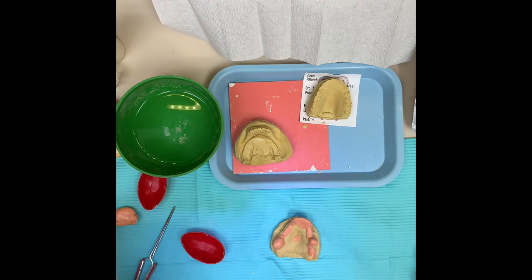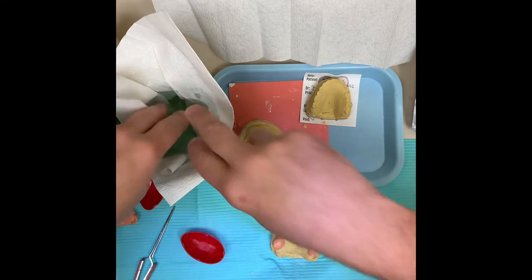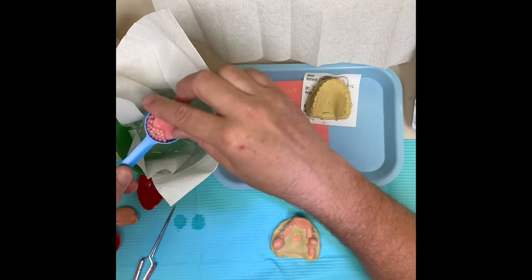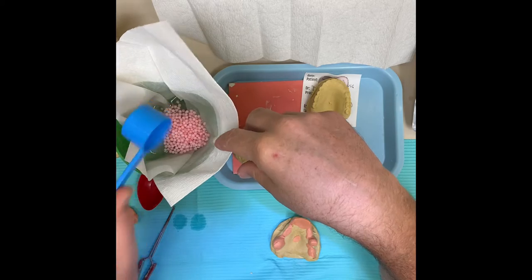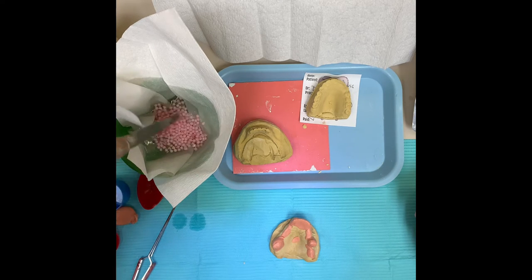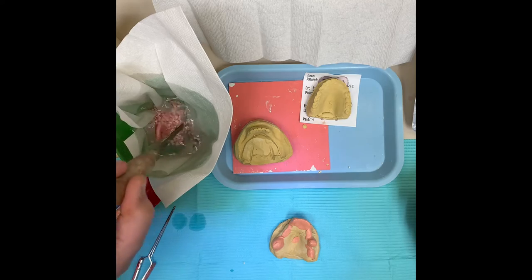The next step is take your paper towel, put it in the hot water. This stuff can get pretty sticky when you get it hot. You want to keep any excess that you have when you do this because you can reuse it to save money. Drop it in - you want roughly a scoop full; it works pretty well for just about everybody. As the little beads are heating up, you'll see them change color and they'll actually become translucent.